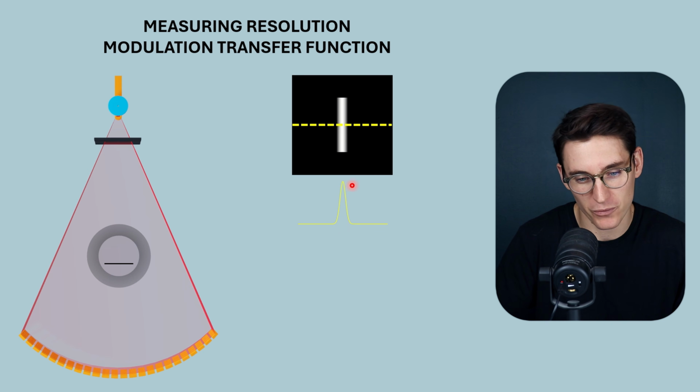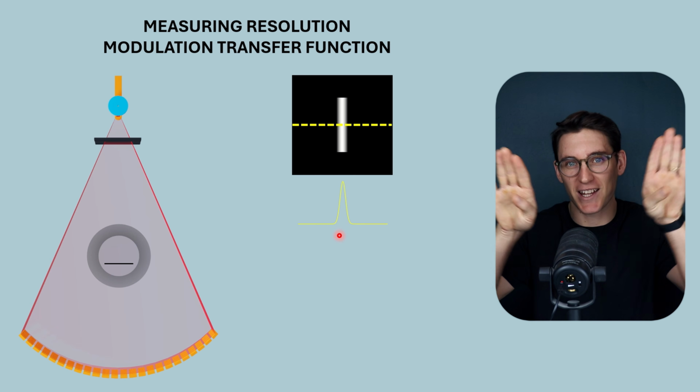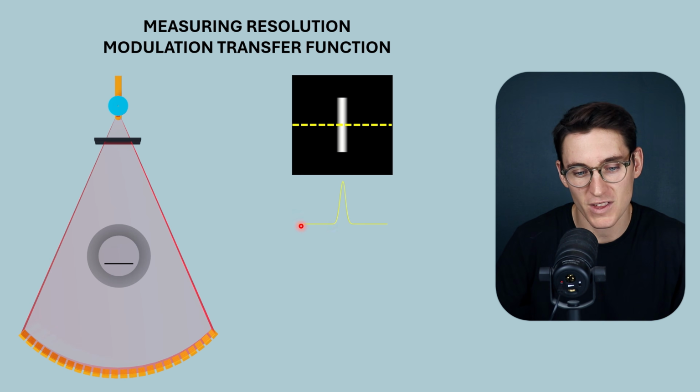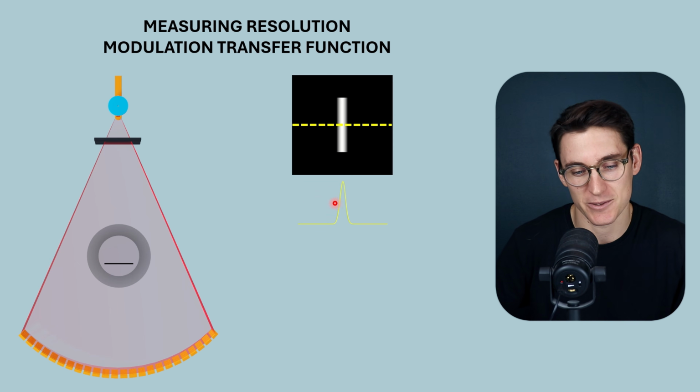Notice how we haven't got perfectly crisp edges here because of the spatial resolution limit of our scan. We can't perfectly differentiate the edge of the attenuating rod from the phantom itself. This plot represents spatial location along the x-axis as well as signal intensity along the y-axis.